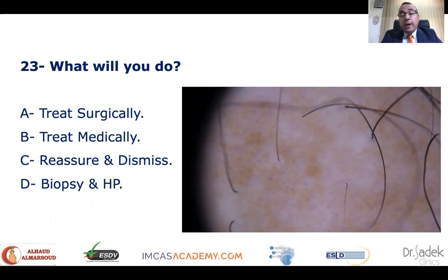Okay, in order to reach that, we have to get a clinical dermoscopic differential diagnosis or a definite diagnosis to be sure. And what we see are diffuse areas of fibrosis. Definitely there is total absence of hair follicles, replaced with some discoloration at some areas, but no signs of any active form of alopecia.